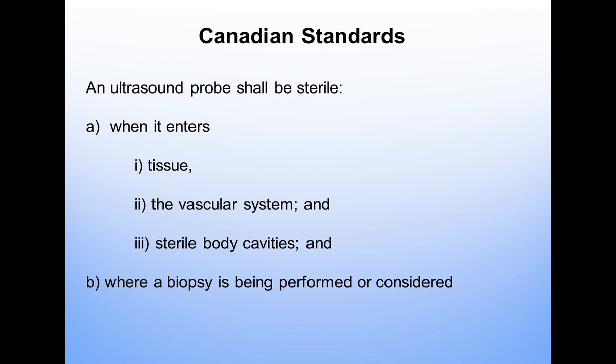Ultrasound probes shall be sterilized when they enter or come in contact with tissue, the vascular system, and sterile body cavities. We all realize that and we're aware of it, but there are still some probes out there that are not sterilized when they're used in the OR theaters. You may use sterile probe covers, but I do know that manufacturers are looking to develop probes that can be sterilized.